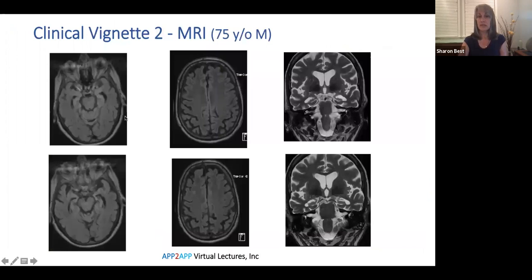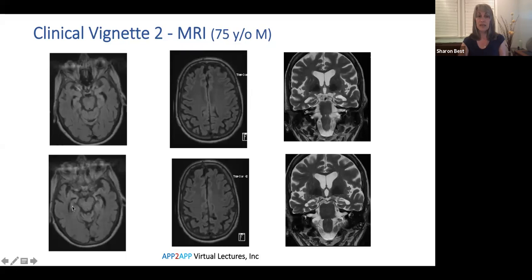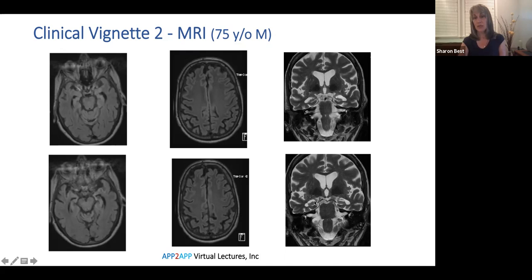Here's the MRI for clinical vignette 2 — this 75-year-old man. At the level of the pons, just when the midbrain and cerebral crura are starting to show, we have the right and left hippocampus, and we can see that the temporal horns are quite wide on either side. One slice superiorly, with the midbrain clearly visible, we can see how thin the hippocampal bodies are. Scrolling superiorly, we're now about half frontal and half parietal, and we can clearly see the intraparietal sulci is more wide compared to the frontal sulci — the parietal cortical atrophy is even more appreciated as we continue to move superiorly. On the coronal view, the choroid fissure and temporal horn have coalesced with quite a bit of cerebrospinal fluid, and we can also appreciate the atrophied hippocampus.